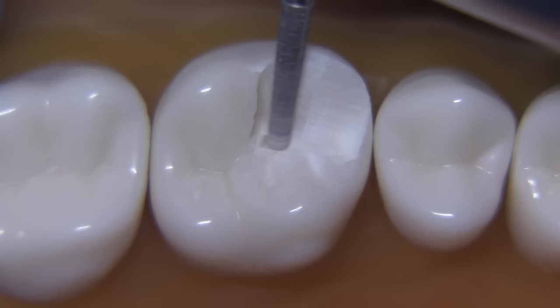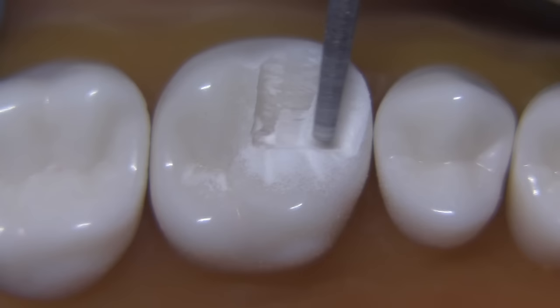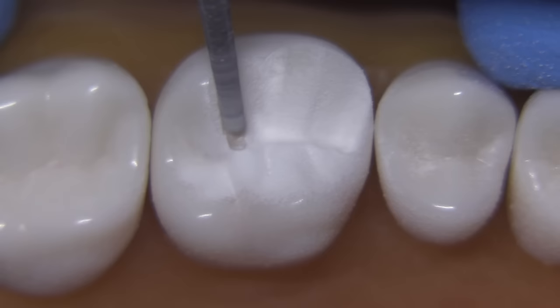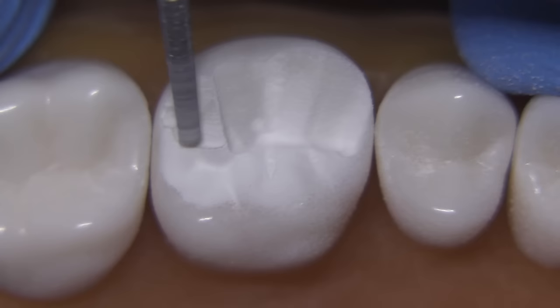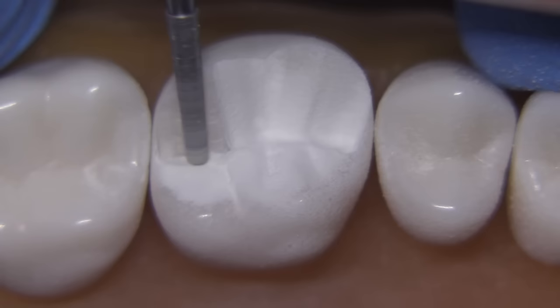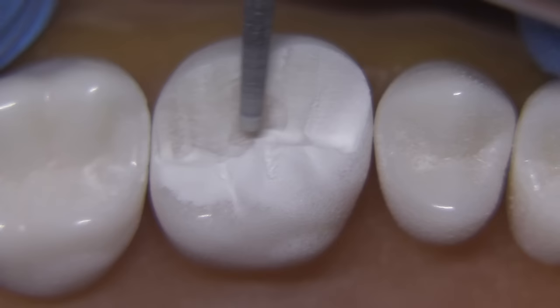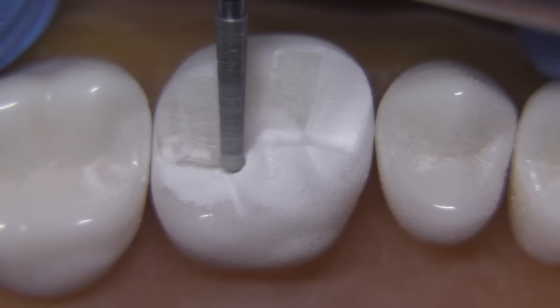We can follow the same pattern with the rest of the tooth. This is the non-functional reduction — I refer to this as the C-plane, and the B-plane will be in between, which is the facial inclines of the lingual cusp. The A-plane or the functional cusp bevel will be on the lingual side of the lingual cusp. The same philosophy can be applied to any PFM, whether you're doing a premolar or maxillary or mandibular molar. It's a systematic approach where each step is done the best you can. There are four individual planes along the C-plane that follow the inclines created off of each of the triangular ridges, with the burr always paralleling the angulation.